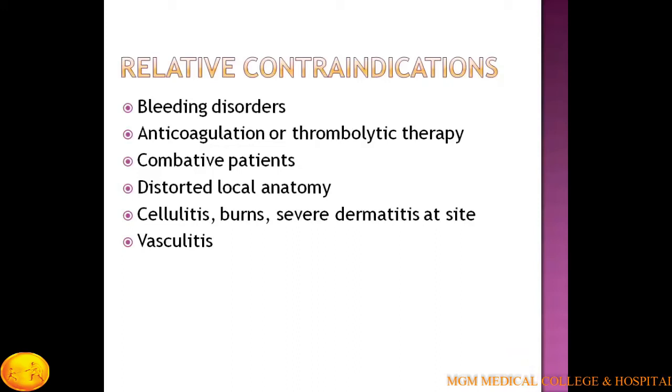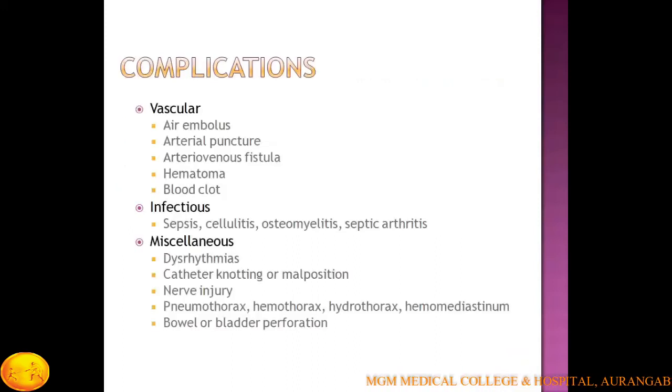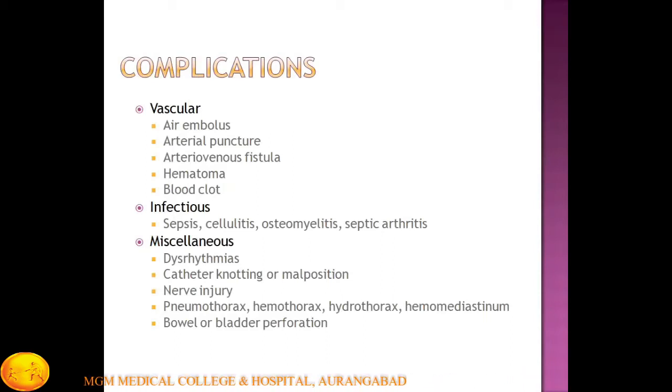You can stop using the central catheter. Now, what will be the complication? These are the complications of any invasive procedure. As you are directly poking the vessel, direct air can go into the vascular system and air embolism can happen.